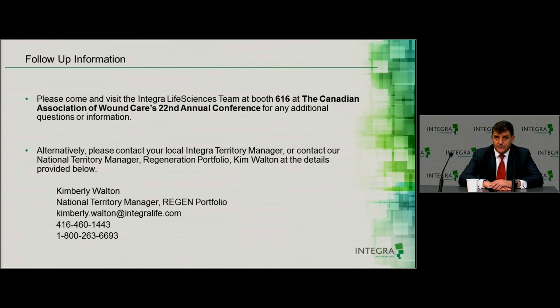I do think that in patients who have significant pain from things like vasculitis and maybe cryoglobulinemia, certainly from pyoderma gangrenosum, all those patients probably should be debrided and treated with IDRT, because there are very nice cases, again and again, multiple anecdotal cases. So we do that at our place.